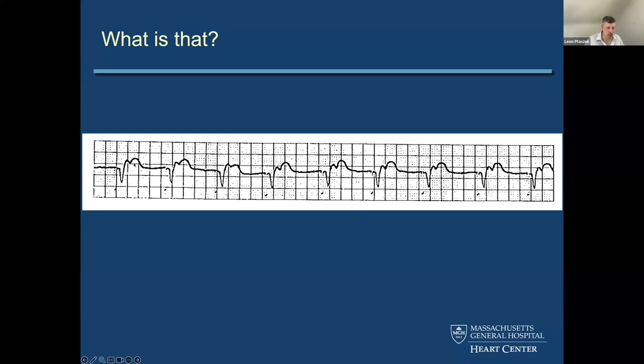But the question I have for the group is, why is there this notch in the ST segment? What do you think that is? Retrograde conduction. Yeah, that's exactly right.